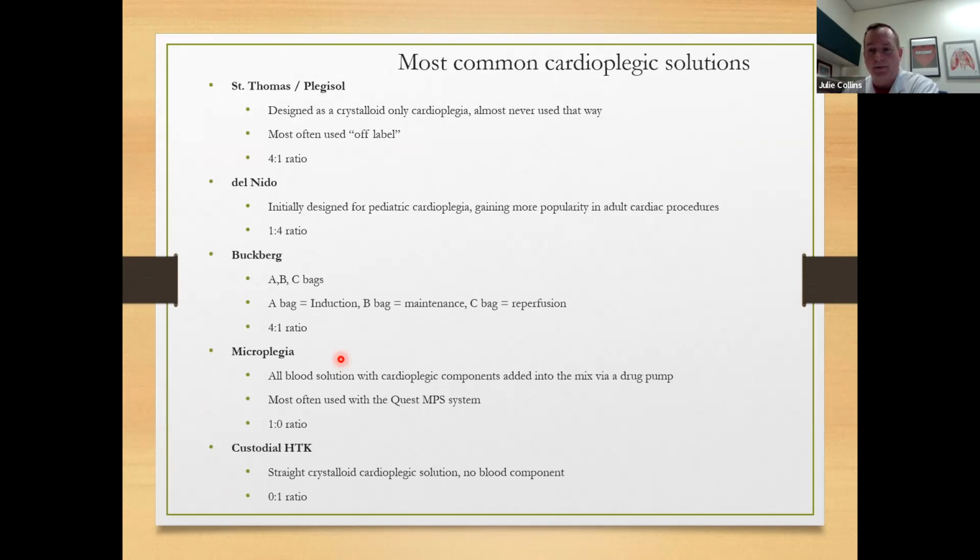More viscous, okay? So if you're taking a cardioplegic solution that is very high in hematocrit and you're cooling it way down and you're trying to force it through the small vasculature of your capillary system in your myocardium, you may not be getting very good cardioplegic distribution. You could be getting a lot of capillary sludging going on.